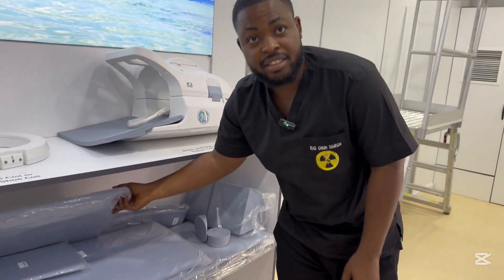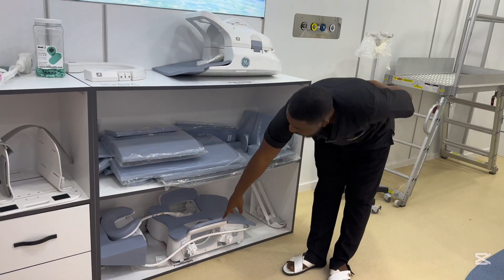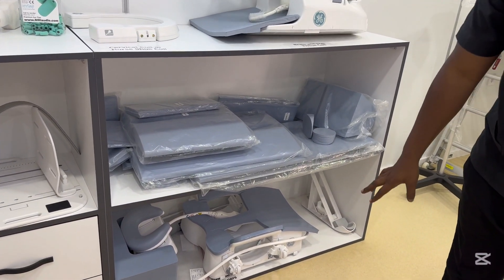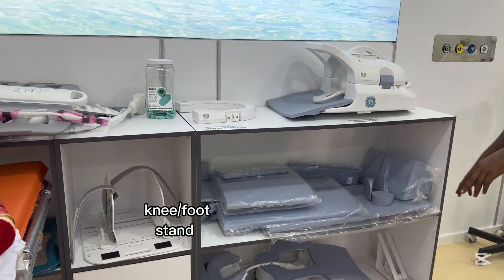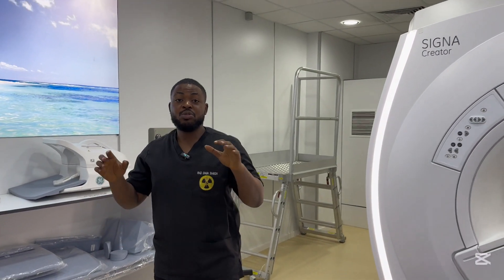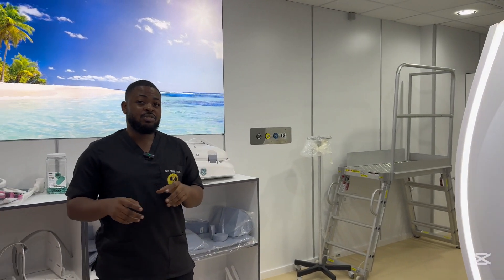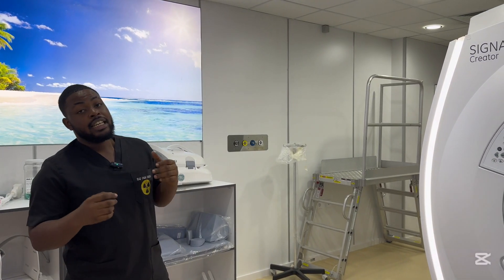All these foam pads help us put the patient in a comfortable position. Down here is our last coil — this one is for breast dynamic studies, so we use it for breasts. MRI is one of the best imaging modalities; it's one of the best modalities in the radiology department right now for checking for any breast mass or breast issues — it's just a little lengthy and costly.